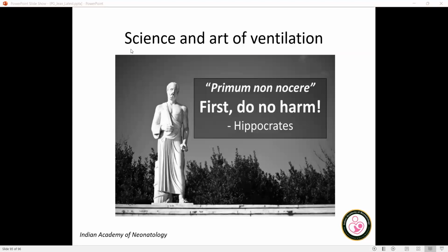Ventilation alone, I don't know, sir. Probably the flow, everything, is directed towards one lung. So if it is volume targeted ventilation, the tidal volume will not be achieved, and the pressure reached would also be high.